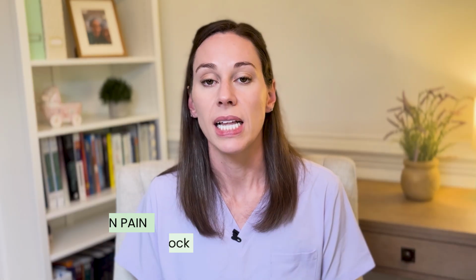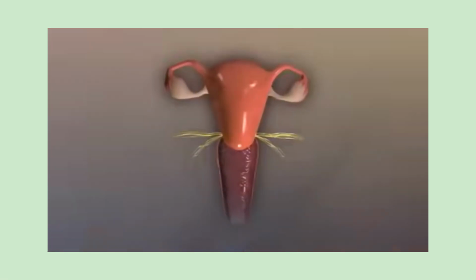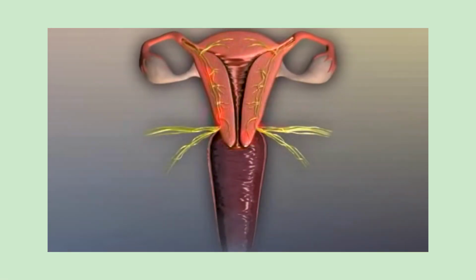This is when we take lidocaine and actually inject it via needle, both on the surface of the cervix and on certain spots on the side of the cervix to attempt to block those nerves from sensing the pain of the procedure. Now, this definitely has some downsides to it because the amount of lidocaine that should be injected to do a good block is about 20 cc's. And 20 cc's is 4 of these syringes amount of fluid injected around the cervix. So that's a pretty good amount of fluid that needs to be injected into those tissues to provide that block.